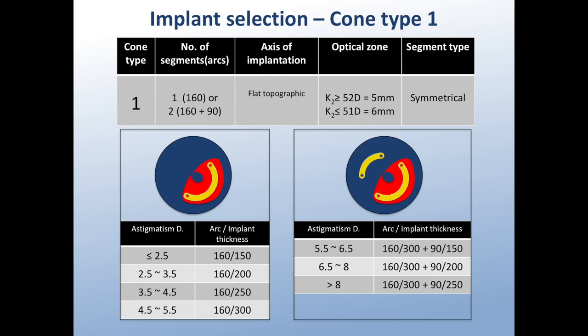That being said, the arc of implantation is always 160 degrees for the 5 millimeters and 150 degrees for the 6 millimeters, and this can induce a little bit of confusion, but you will soon get used to it. So we understand that the ring to be implanted is 5 or 6 millimeters. The arc is that of 150 degrees or 160 degrees.